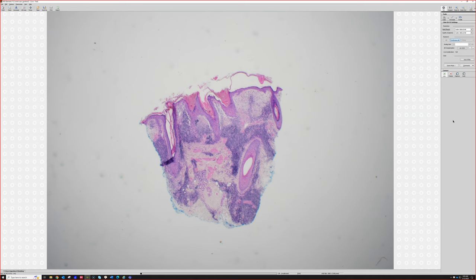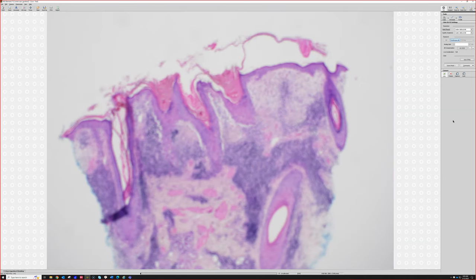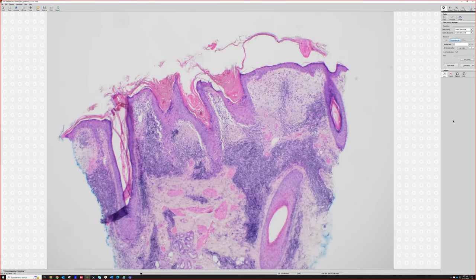But it's good to think of lichen planopilaris and lupus erythematosus and, to some extent, CCCA, central centrifugal cicatricial alopecia, in the setting of the scalp. Those can all have some degree of overlapping features, fibrosis and inflammation, and the pattern of those mixed with the clinical can help sort out which one it is. But here we're probably somewhere else, not on the scalp, I imagine. I think we're probably on the face here, but it could be the trunk. I might be wrong.